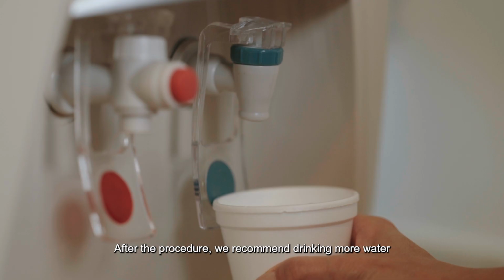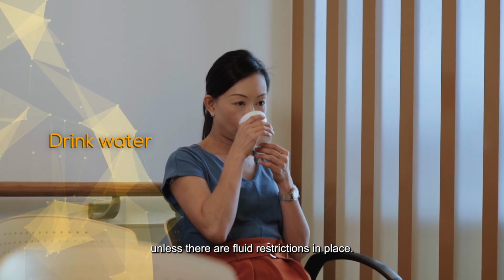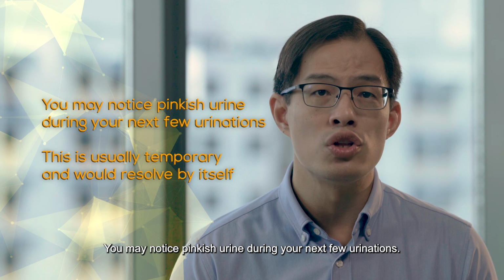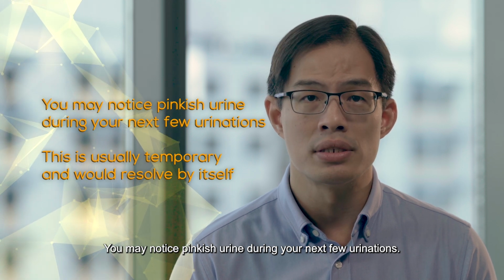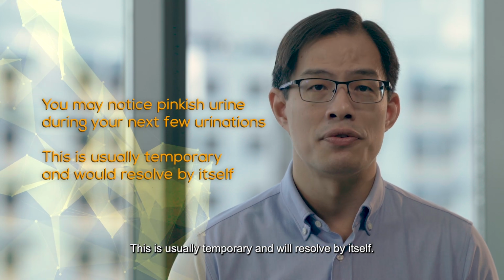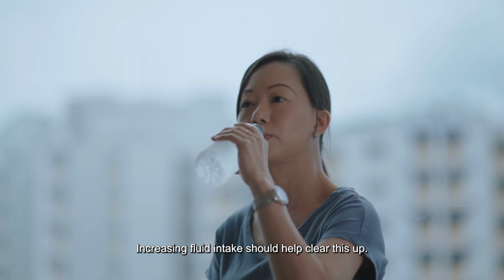After the procedure, we recommend drinking more water unless there are fluid restrictions in place. You may notice pinkish urine during your next few urinations. This is usually temporary and will resolve by itself. Increasing fluid intake should help clear this up.